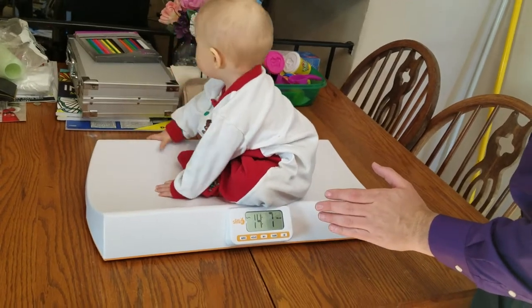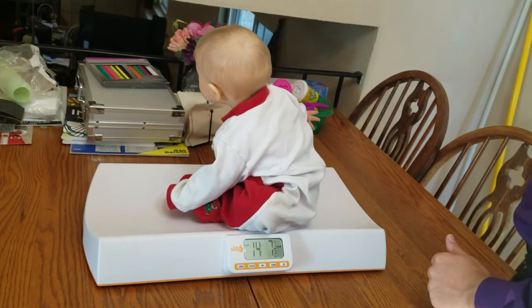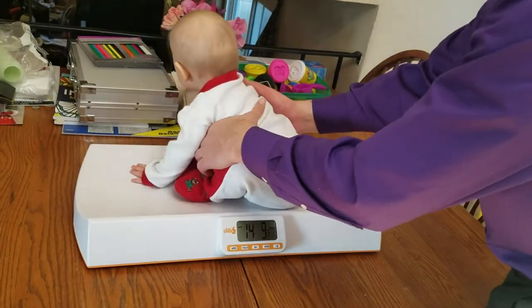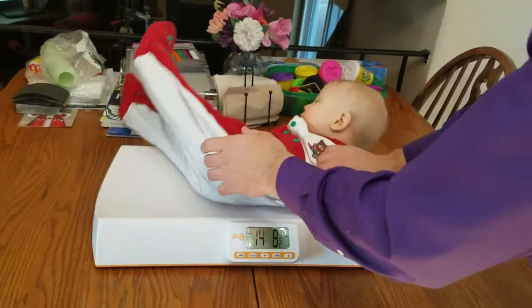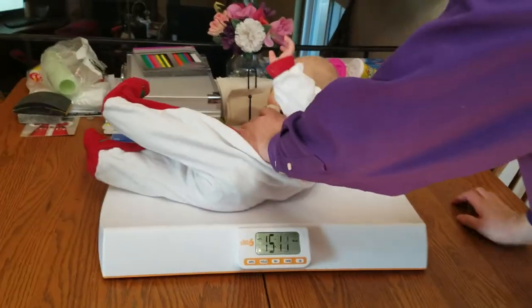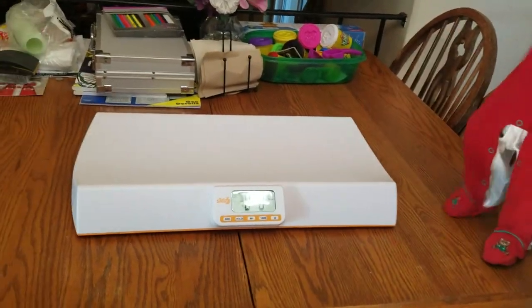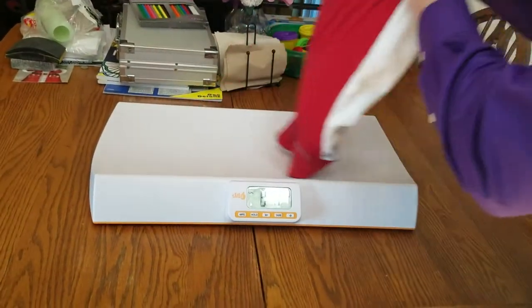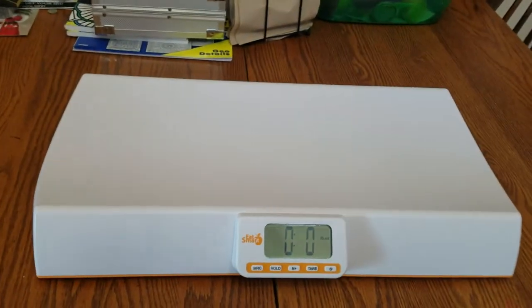Obviously when you weigh your babies you want to do it the same each time, so if you do it in the diaper, whatever. One of the things — this is where we kind of had the problem with ours — she doesn't like the idea of sitting down like they do at the doctor's office. Go ahead and put her back on — she is not okay, maybe not.